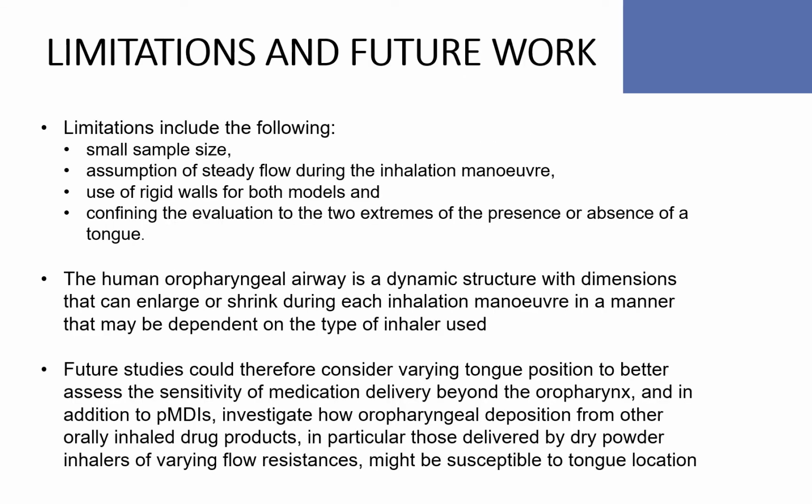So obviously there are some limitations to our work here. It's obviously a very small sample size, an N of 1. We've assumed steady flow conditions rather than an inhalation maneuver, and also the fact that this nylon model is made of rigid construction, whereas the human oropharyngeal airway is going to be dynamic and going to stretch and enlarge depending on how things are taking place during the inhalation maneuver. Also, the fact that we've gone to two extremes, one with the tongue in its natural position and then where we've removed it entirely, which is very unnatural. So future studies should look to vary tongue position to better assess how sensitive this is to deposition.